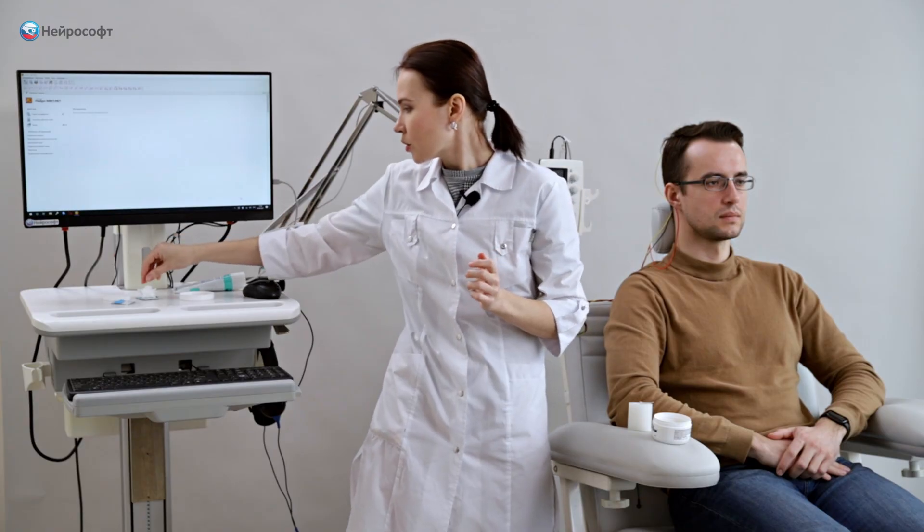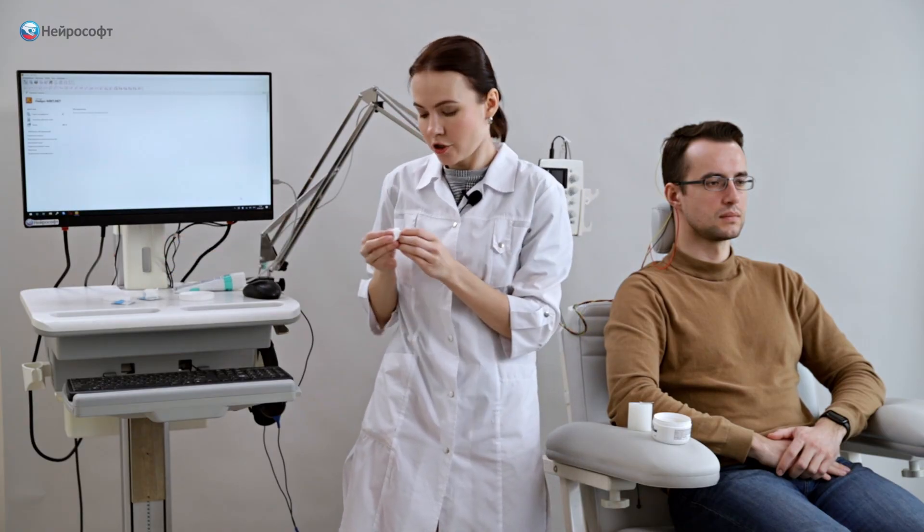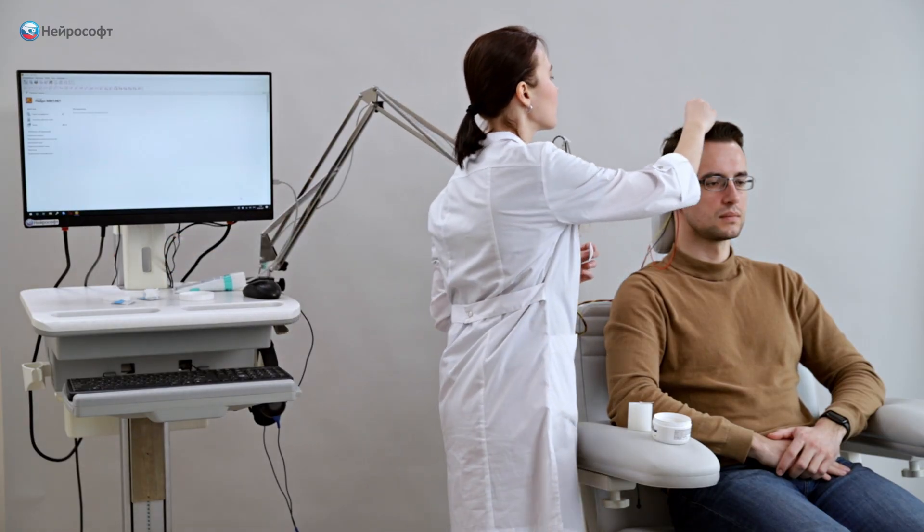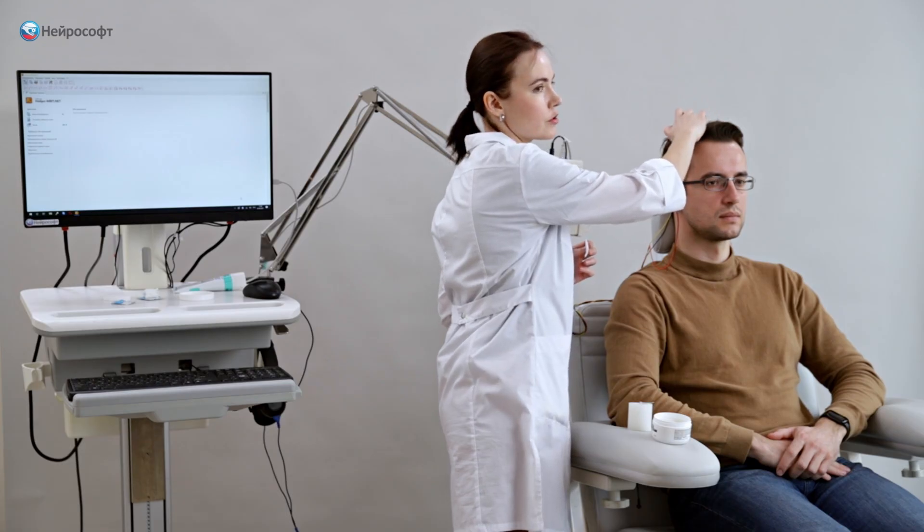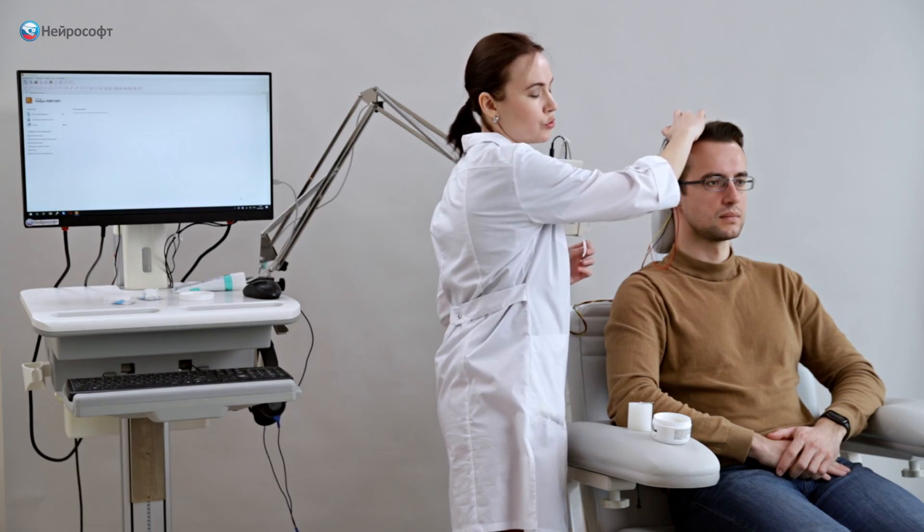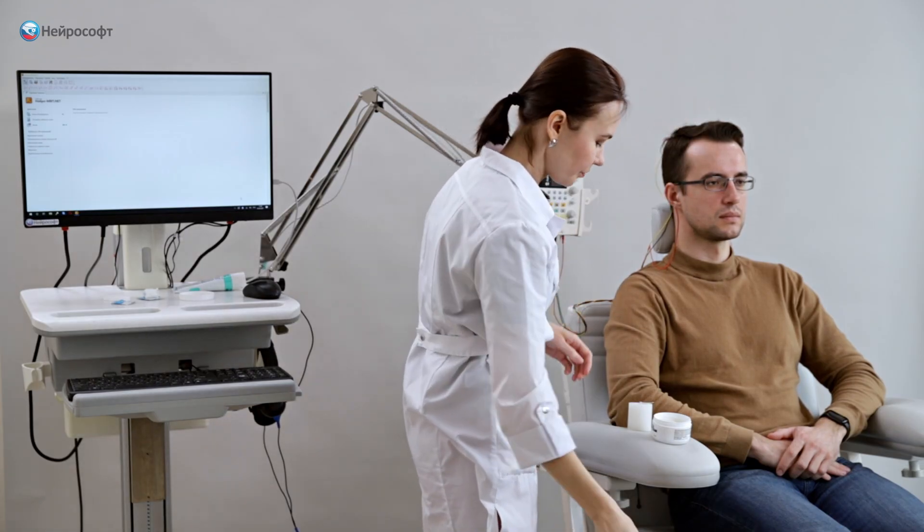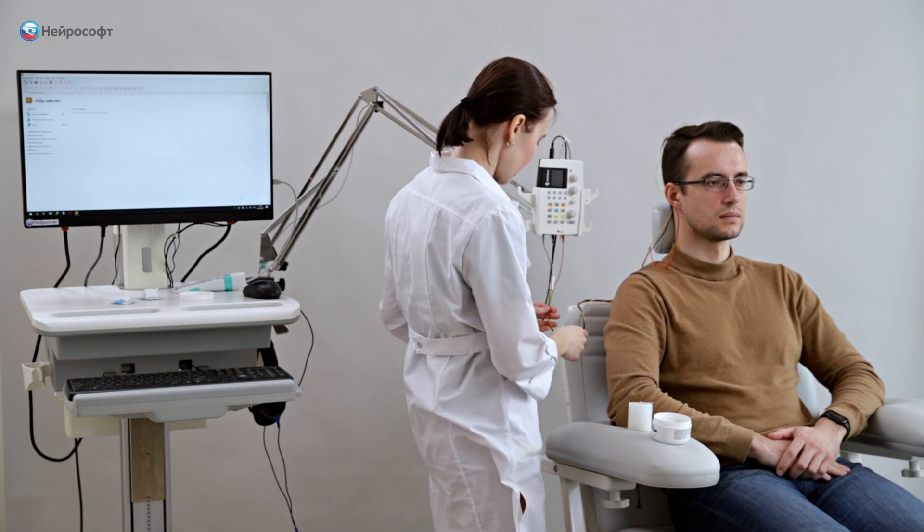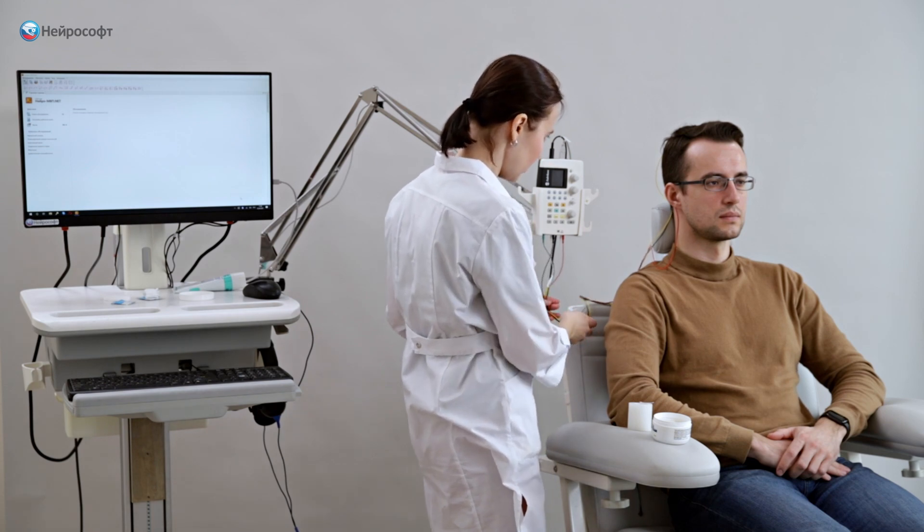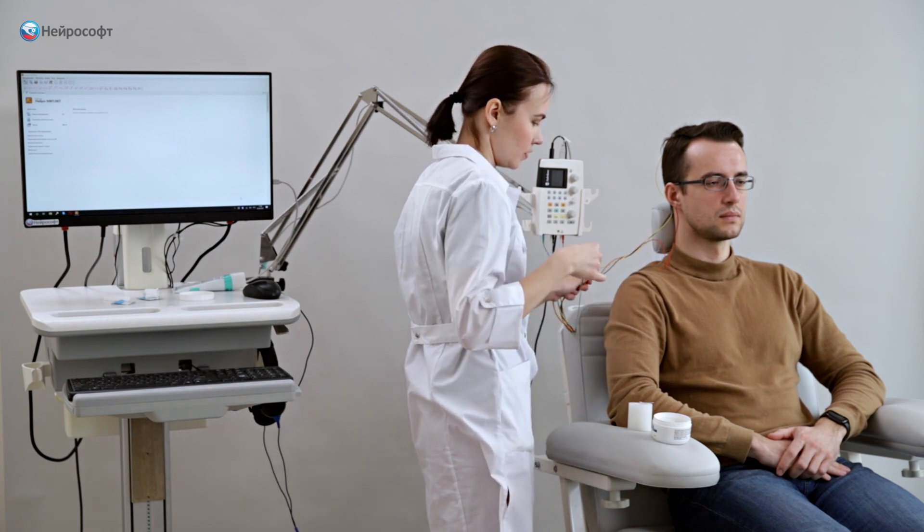To improve fixation and lower the subelectrode impedance, a napkin moistened with physiological solution can be placed on top of the electrode. The grounding electrode is placed on the forehead skin, also fixed with a medical tape for reliability.